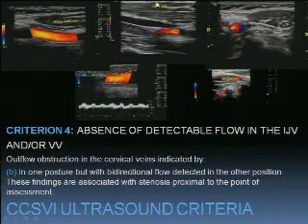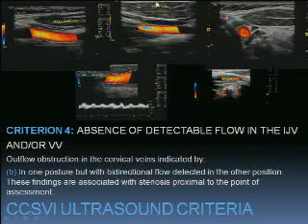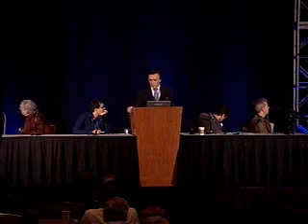We start to try to estimate the volume flow in the internal jugular vein, and we get many measurements, at least 10 measurements along the whole length, and we try to estimate the mean volume flow. So far, it seems that in healthy control subjects, the mean volume flow is much higher than in patients with MS.